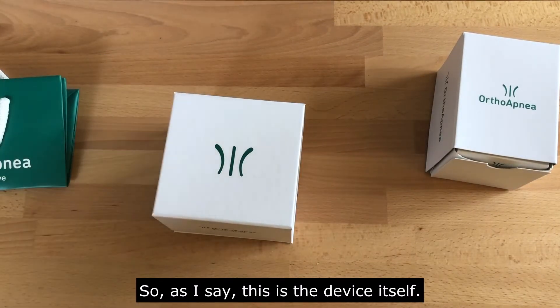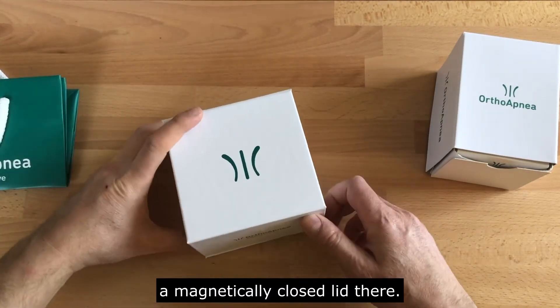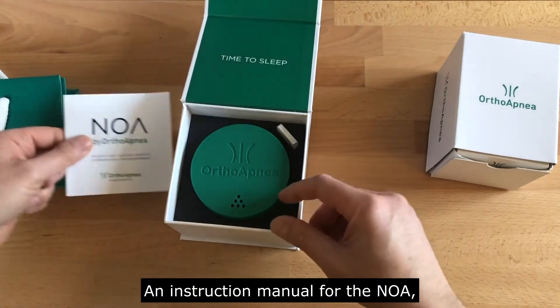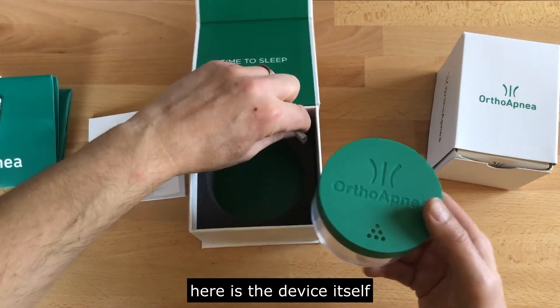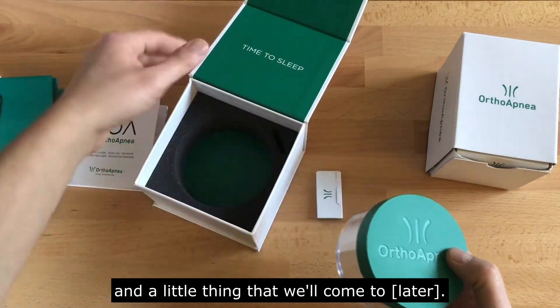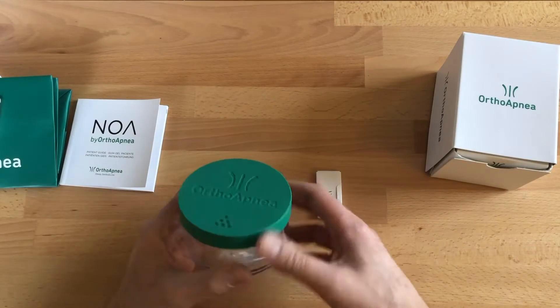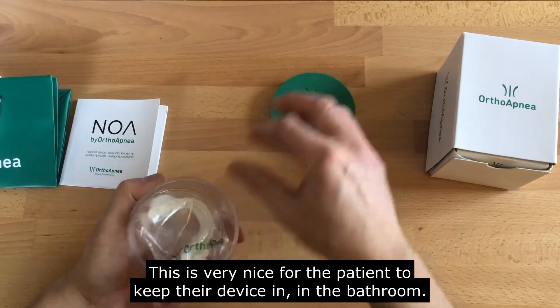This is the device itself. Open it up — magnetically closed lid. There's an instruction manual for the NOA, and here is the device itself, along with a little accessory we'll come to. This is very nice for the patient to keep their device in the bathroom.